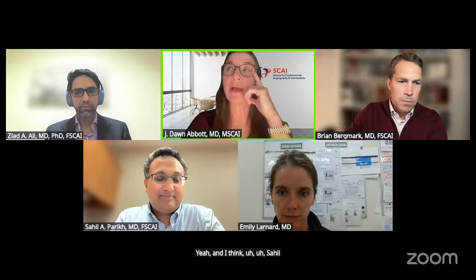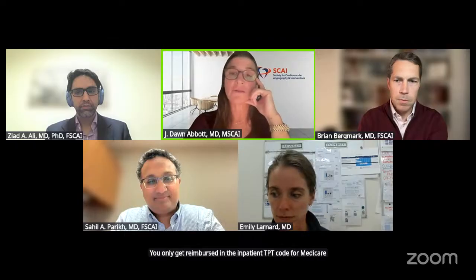Yeah, and I think Sahil, you mentioned this, but we do not get reimbursed for DCBs. They cost $5,300 to $5,600. We only get reimbursed in the inpatient TPT code for Medicare. So if you have an outpatient, it makes sense to do roto or laser before you apply DCB financially. I'm not saying do it just for the money, but it does.